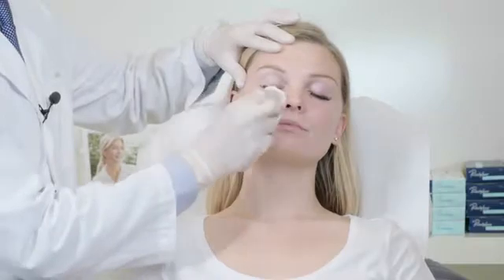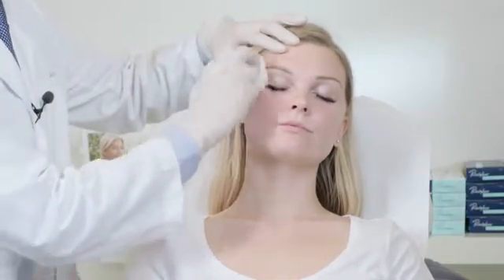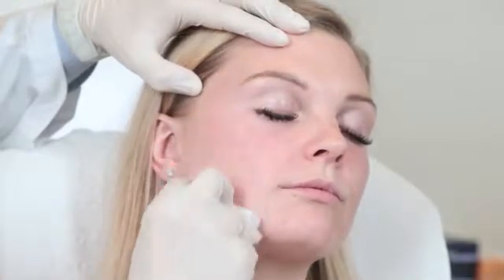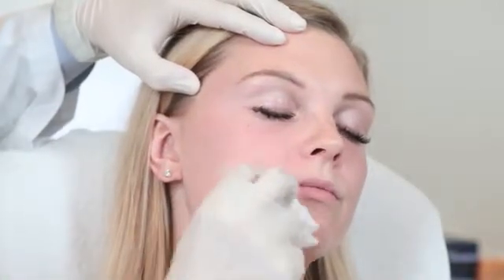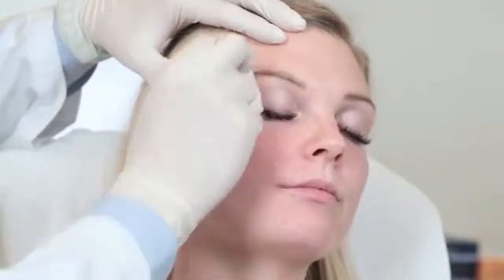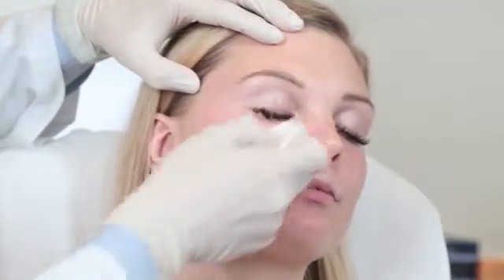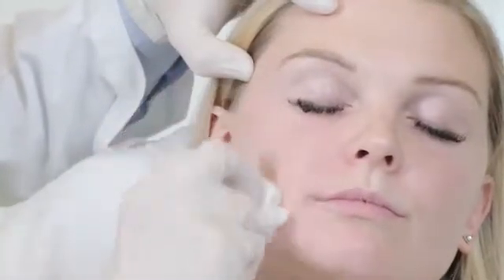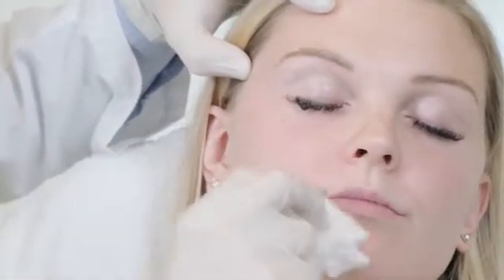When working with injectables, especially when using a microcannula, it's important to really remove makeup and cleanse the face with an antiseptic lotion all over, not just at the entry point, as the cannula will wander around over the cheek. And also try not to draw it over the skin, always have some air in between.